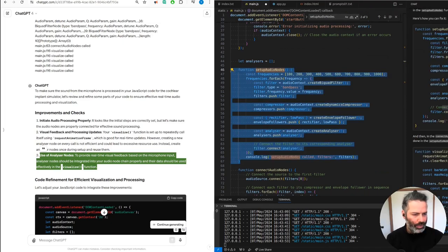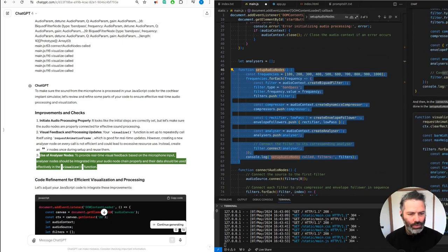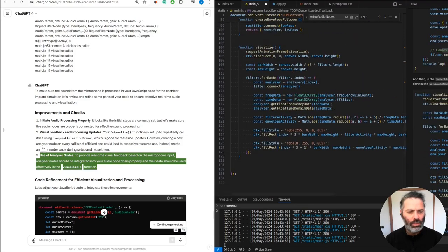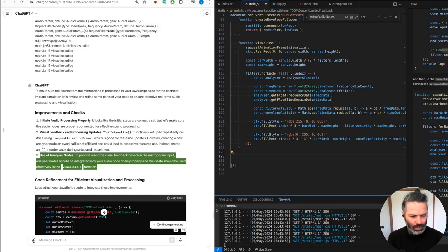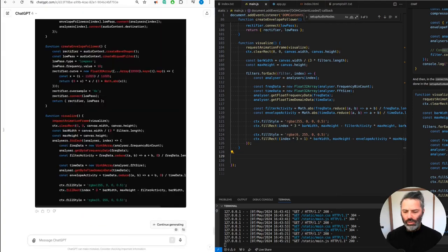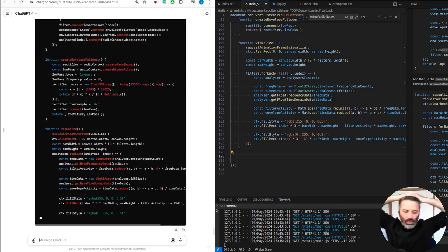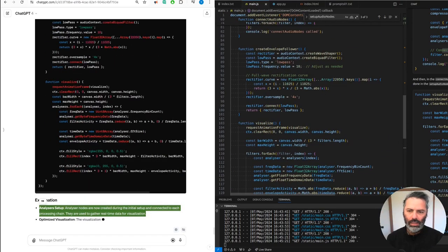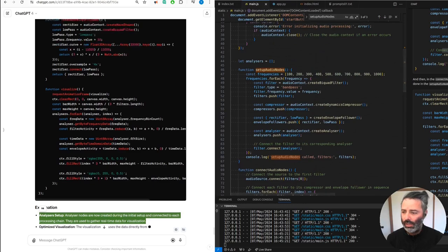Should remove the line where the filter is connected to the analyzer because it's already done, so we're not doing it in visualize. This way, the data is used effectively in the visualize function. No. Did it regenerate the whole code? I didn't ask it to, but okay. I thought we have Copilot doing the actual coding. Then Copilot is also struggling.